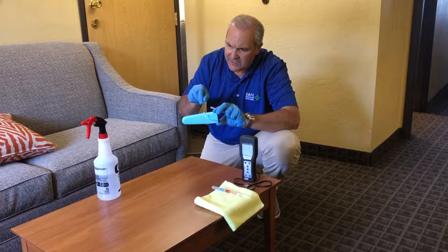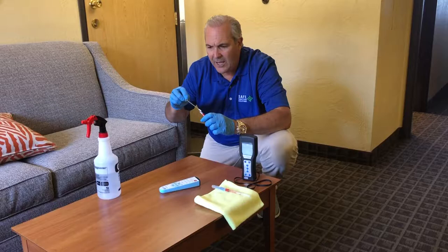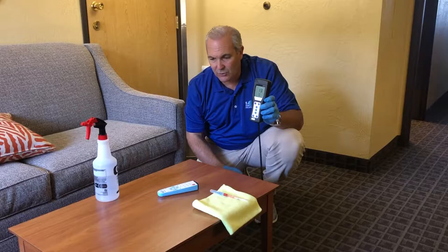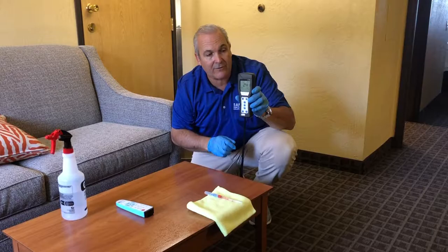I'm going to do this to get a feel for the surface as well, and this will go inside. Do a little crack here — this will go in our tester. In 15 seconds it's going to give us a reading. While I'm getting that reading, I'm going to spray the table with dandelite. You can see that I'm just using a simple spray bottle that has the dandelite mixture inside of it.